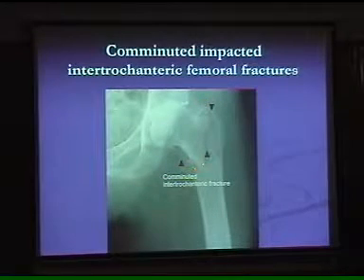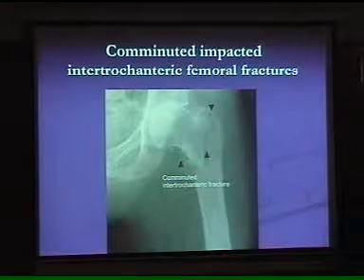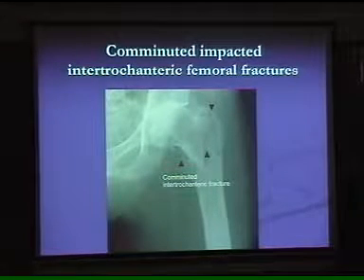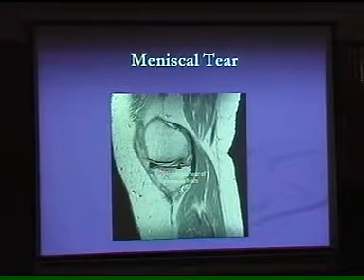If you look at the greater trochanter, look at the lesser trochanter, and look at the lucent line in between dividing the two, that's the comminuted fracture. And there's one segment over here as well. It's a comminuted intertrochanteric fracture of the left hip joint, left neck of the femur. And that is tears.